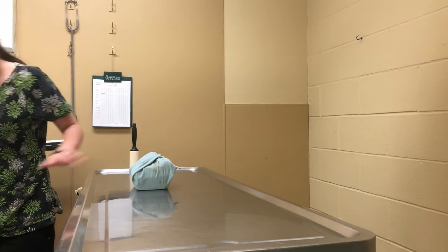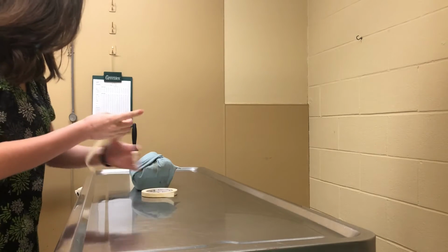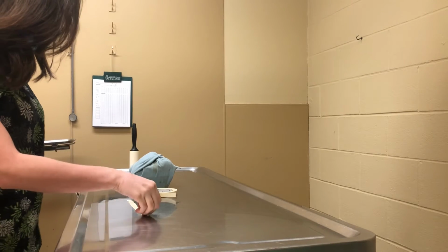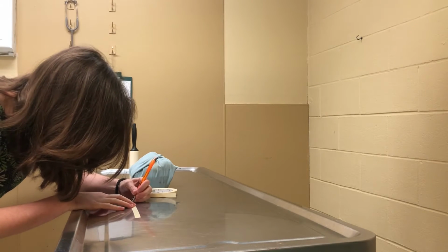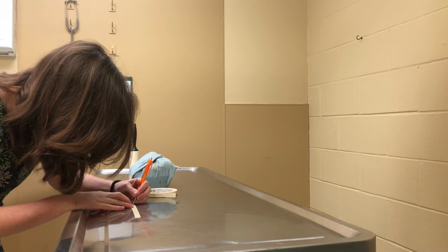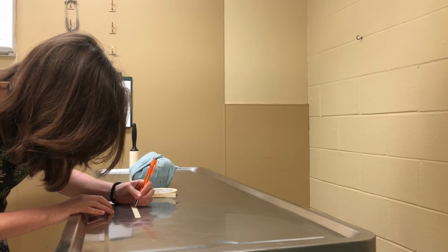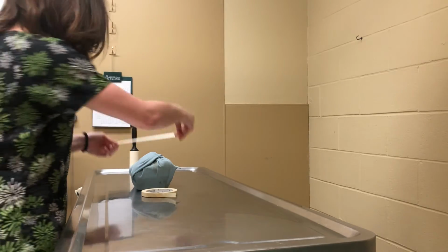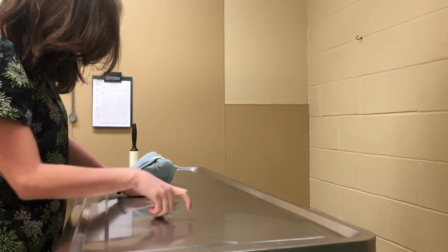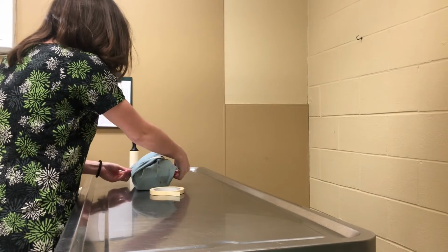Our pack is all wrapped up, so I'm going to take my tape and initial it. I'm going to put the date, and then I'm going to write that it is the spay pack. Put that right on here, just like the gown. And now this one is also ready to go in the autoclave as well.